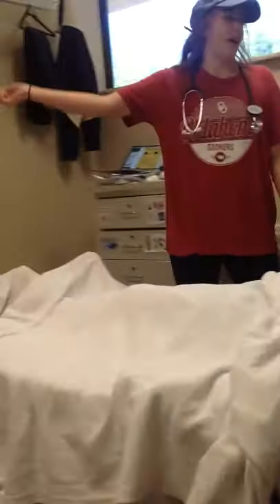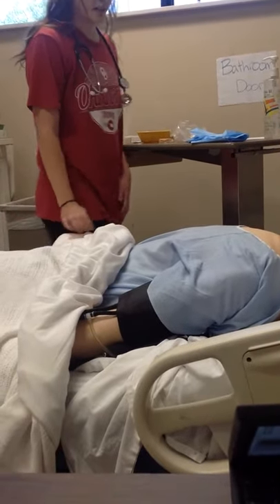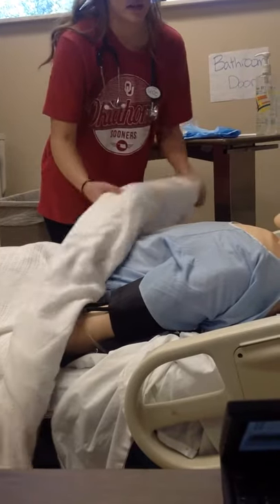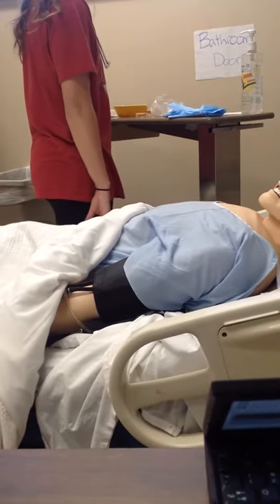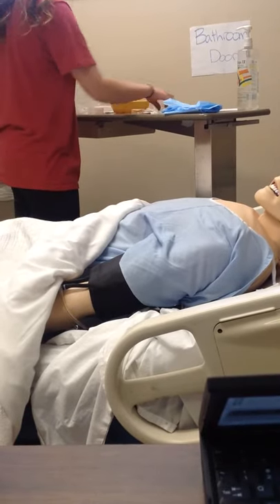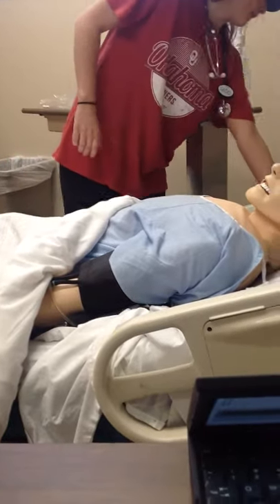I'm going to close the curtain for your privacy. So today we're just going to be putting in a nasogastric tube for feeding and to get that food in your stomach for you so you don't feel so nauseated. And I'm going to assemble my equipment. Do you have any allergies? No. I'm just going to raise your bed up really quick.